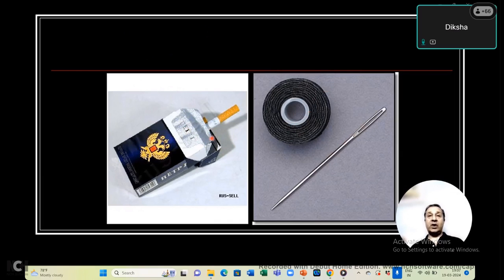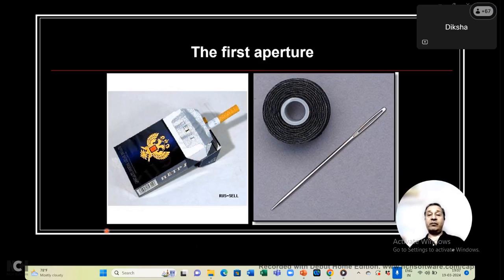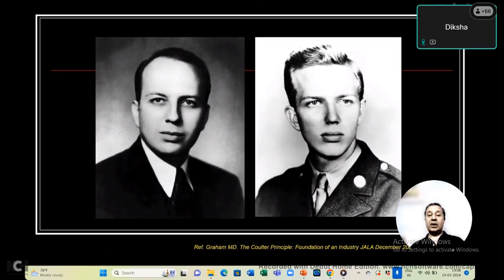Separating the two electrodes. And then from there, the cells would pass through. And this constituted what was called the first aperture in the case of the Coulter principle. So these were the Coulter brothers in their younger days when they looked at it as a methodology of defining how the paint would look, and for that they actually used their own blood to decide how the analyzer was going to work.